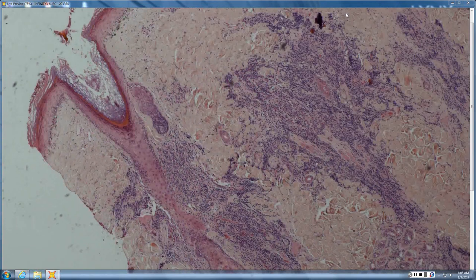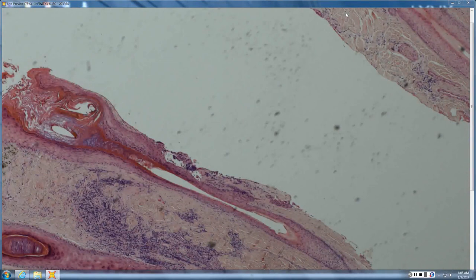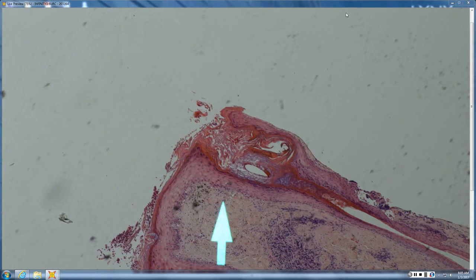So, in this power, all I can see is lymphocytic infiltrate. I'm not sure if there's any other infiltrate in there. And what portion of the follicle? It's affecting the isthmus. The isthmus, very good. And what else do you see? I see vacuolar infiltrates at the DEJ, and pigment incontinence at the DEJ, follicular plugging. So I have an isthmic infiltrate and lupus. Very good. So you've got pigment incontinence, interface dermatitis, infiltrate that hugs the isthmus and is lymphoid, follicular plugging. Looks like lupus.